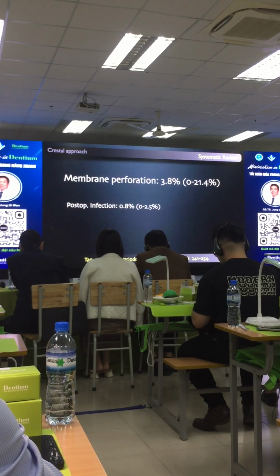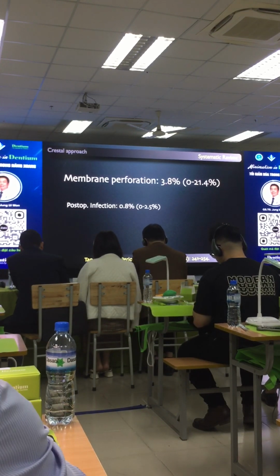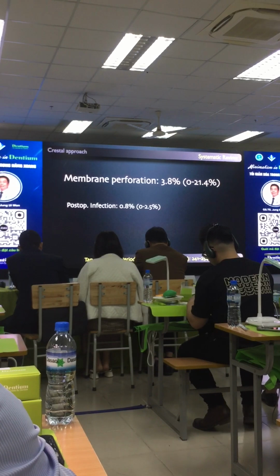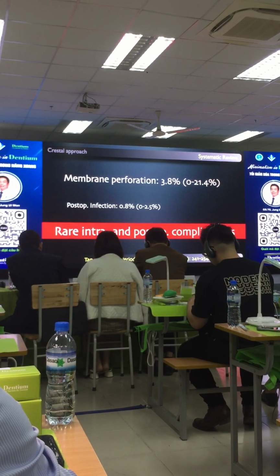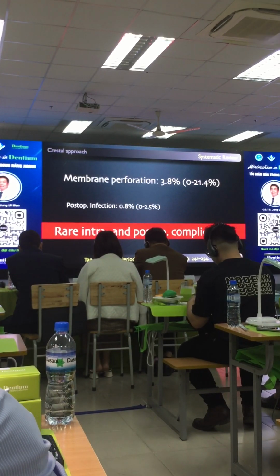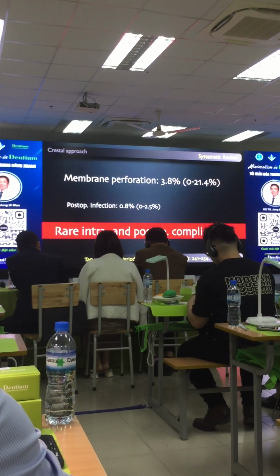On the use of the crestal technique, the perforation rate of the maxillary sinus was on average 3.8%, with postoperative infection at 0.8%, less than 1%. Complications involved with the surgery are generally low.